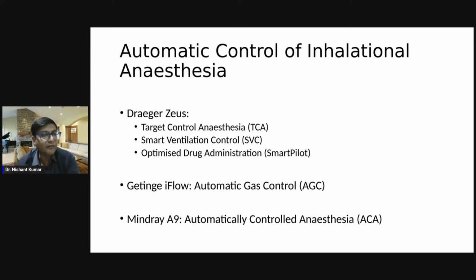And then we set the fresh gas flow. If the patient becomes lighter, or if we have to suddenly increase the depth of the anesthesia, we either increase the vaporizer setting, we increase the dial setting, or we increase the fresh gas flow. So everything is being done manually based on the input received from the patient. That is a semi-closed system. That is how it is being done.